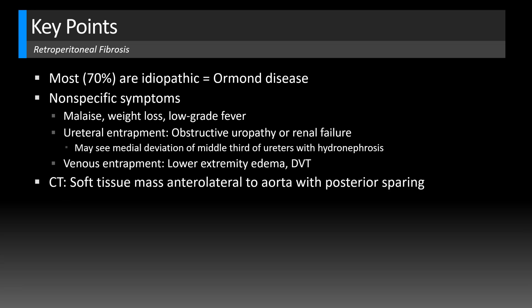On CT, you'll typically see a soft tissue mass anterolateral to the aorta with posterior sparing, and that's very helpful to differentiate from the main differential for retroperitoneal fibrosis, which is retroperitoneal lymphoma. Lymphoma tends to be a little more bulky and will also extend posterior to the aorta and displace it anteriorly — so you can remember: lymphoma will lift the aorta.